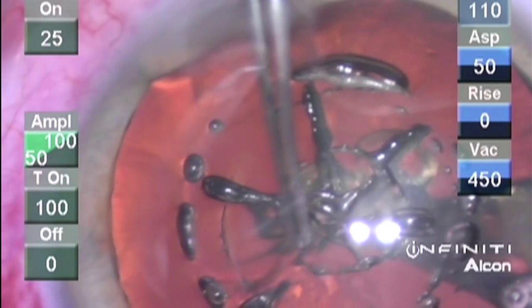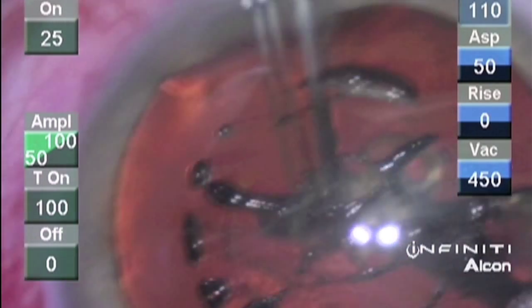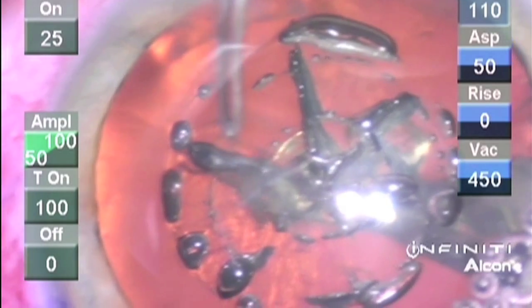In our earliest experience with the LensX, we, in fact, found that there were many postage stamp type adhesions, hence the term postage stamp capsulotomy.